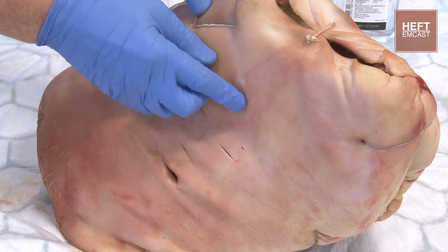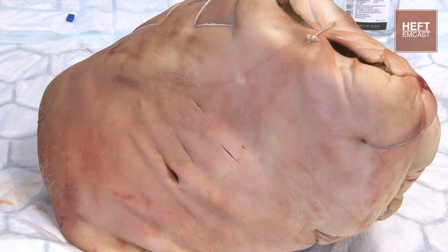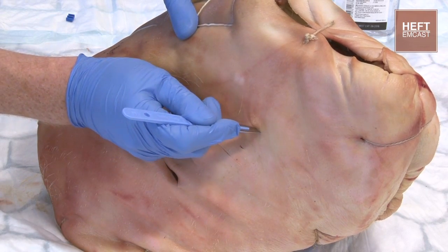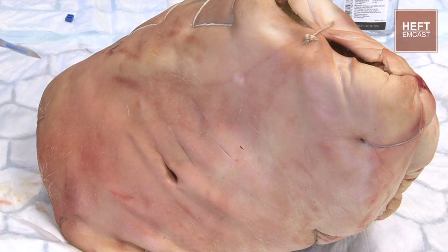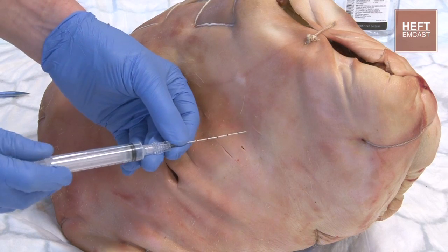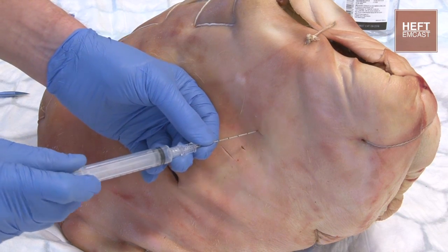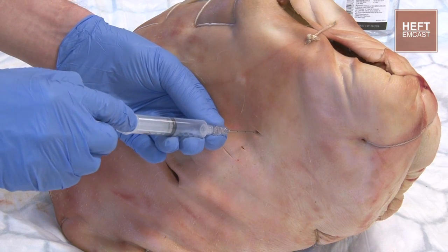So I'm going to start off by identifying our landmarks and coming down to the right intercostal space. I'm going to clean and infiltrate with lignocaine. Then we're going to make an incision in the skin — not as big as for an open chest drain. Then we're going to get our introducer needle and our syringe, and we're going to aim this into the chest through that incision, aspirating as we go until we find we're in the pleural space.